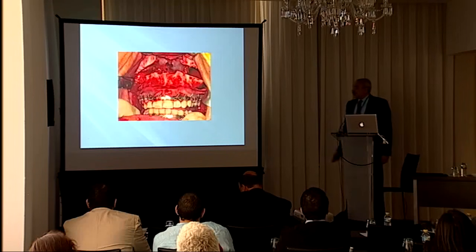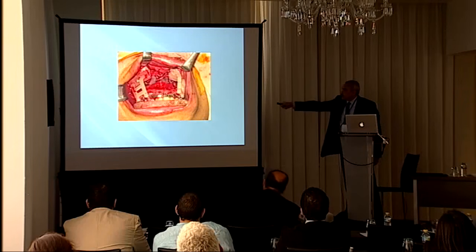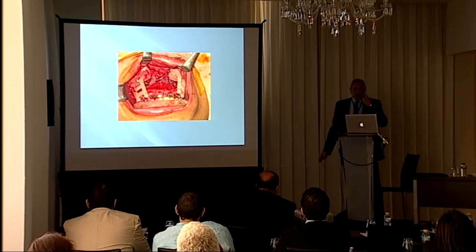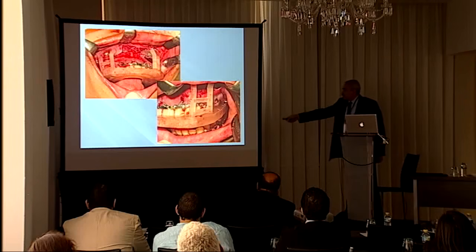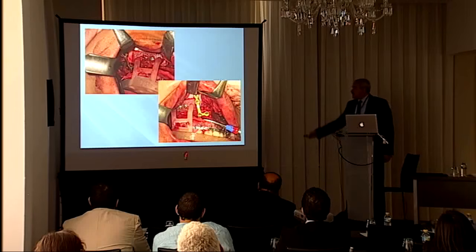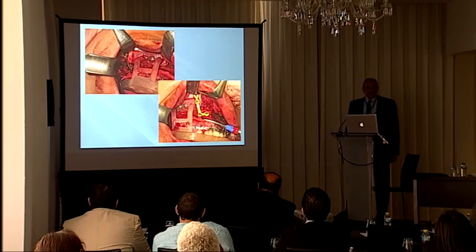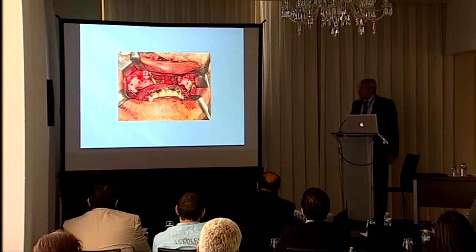We grind whatever is necessary, then we place the 2 splints that fit just in front of the zygoma with the 2 rods, and we move the maxilla to fit. And when these rods fit inside the splint on both sides, this makes sure that we adjusted the maxilla to the exact needed postoperative position. We start applying the bone plates, and now the maxilla is fixed.